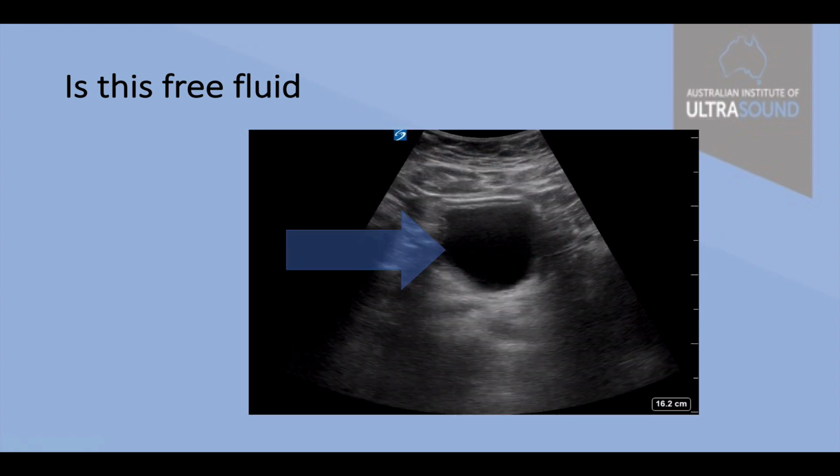This one, bounded fluid again, constrained fluid, even appears to have a capsule. This is bladder, I think.